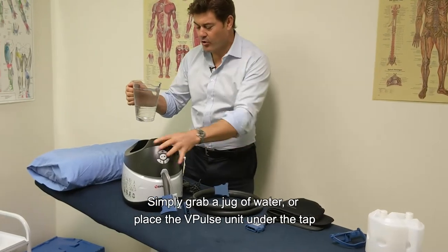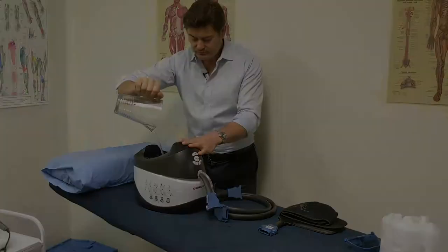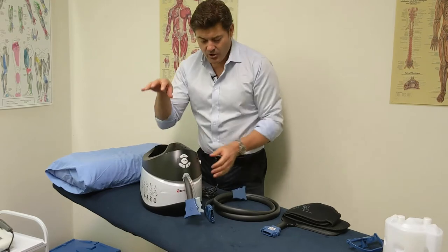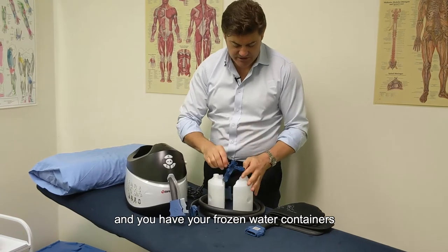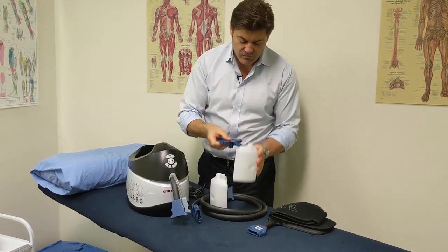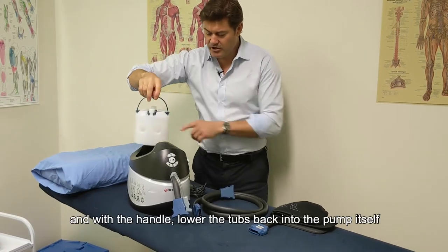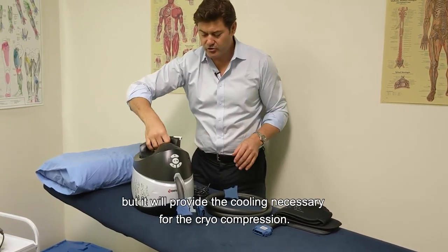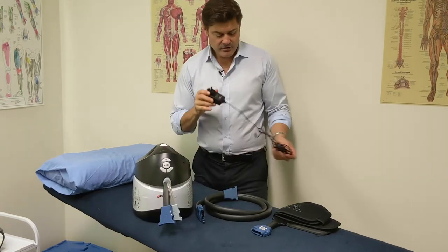Grab a jug of water or place the V-Pulse unit under the tap and pour water directly into the vessel. Check that the water line inside matches the water line on the sticker indicator. Once the water is in and you have your frozen containers, a little trick when putting the handle back on is to make sure the stem faces down. Click it together, then lower the tubs back into the pump — they'll float on top of the water and provide the cooling necessary for cryo compression.